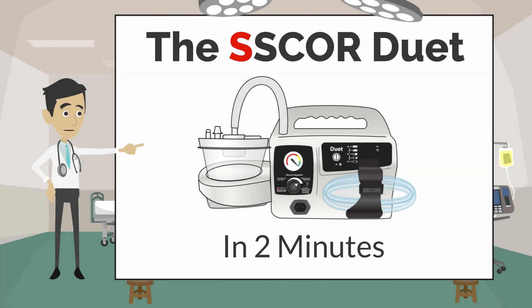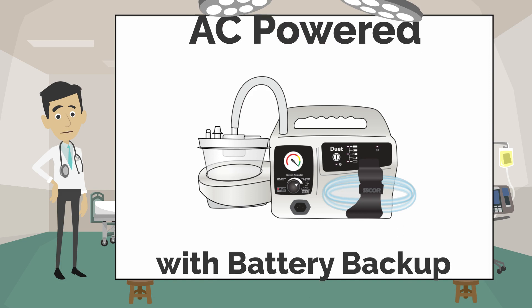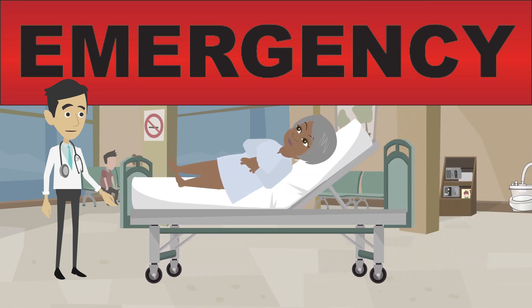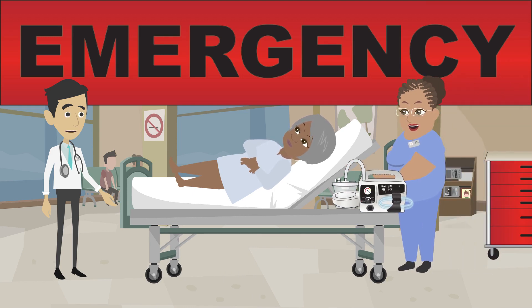Welcome to the SSCOR Duet in 2 Minutes. The SSCOR Duet is an AC-powered aspirator with battery backup. When an emergency situation occurs that requires suction away from the standard wall outlet, the Duet is ready to help. This is exactly what the Duet is designed for.